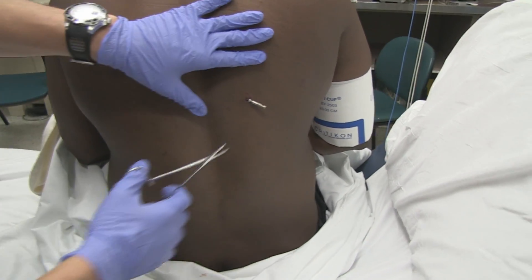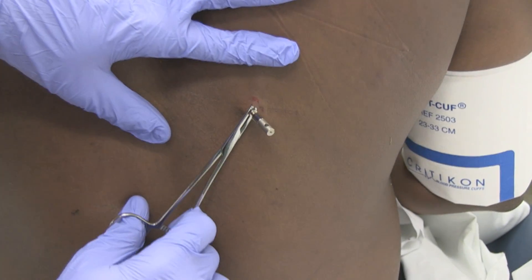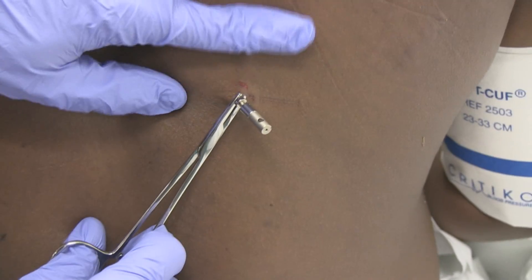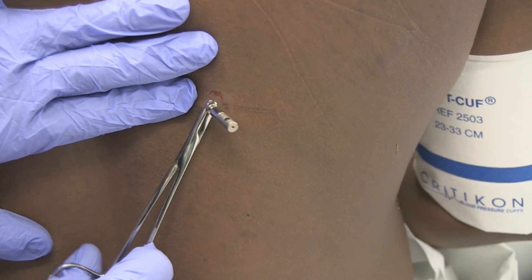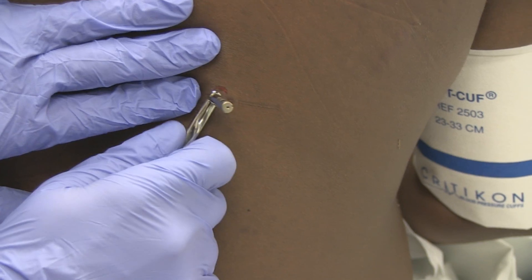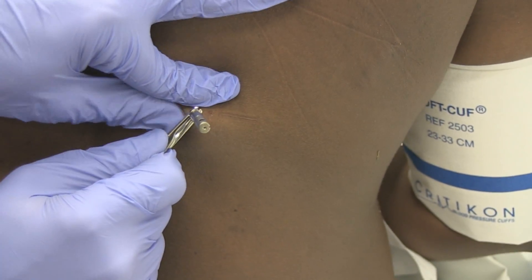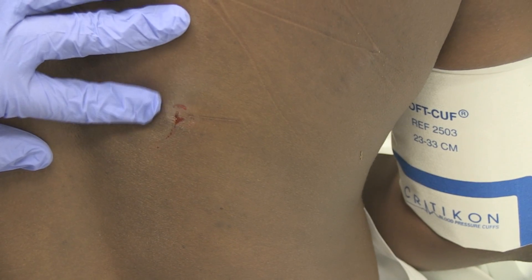I have the needle driver here. I'm going to grasp the barb right there. I'm going to just do a smooth, quick motion — 90 degrees — and pull it out. Three, two, one, two, three. And it's out.